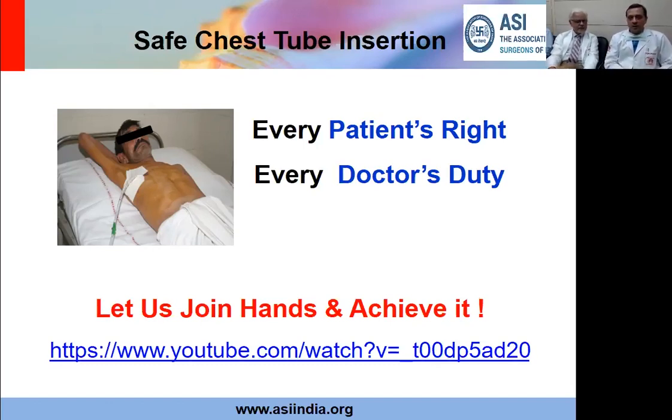So I think it's a very clear message that you have given, that mere presence of a chest tube is not an indication for antimicrobial therapy. No. There has to be some other condition or other reason for it. That's right. But having ensured that you've taken aseptic precautions. Absolutely.